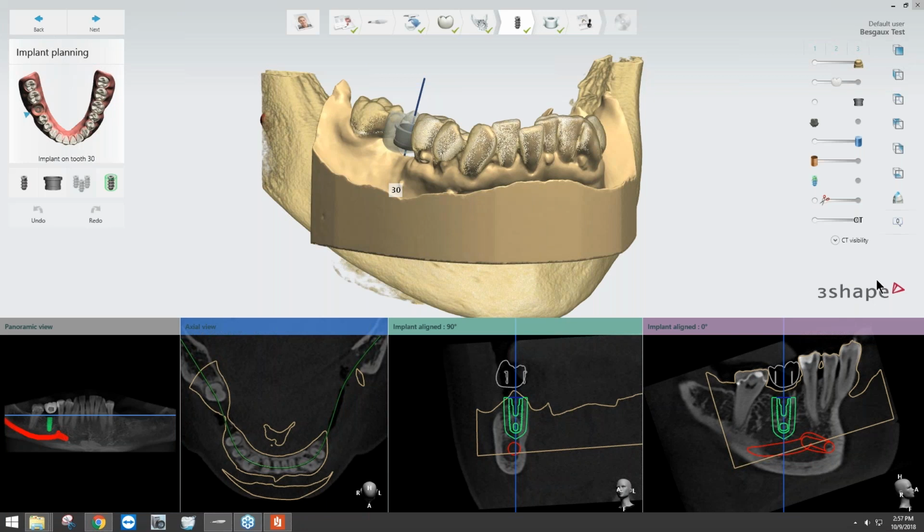In terms of how many implants each guide is recommended to support, it varies. It's mainly based on what printer material you're working with. You'd want to contact your printer manufacturer to determine the maximum amount of implants that it's able to support for the placement.